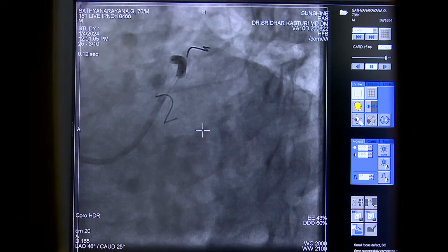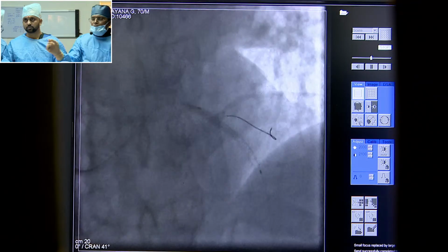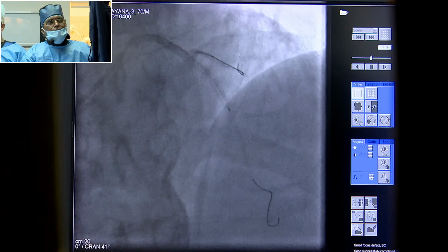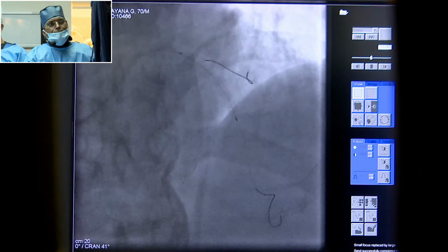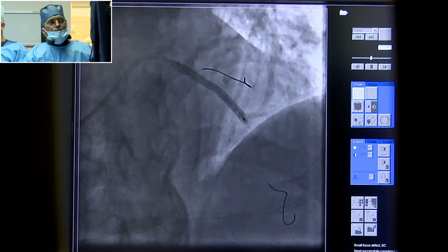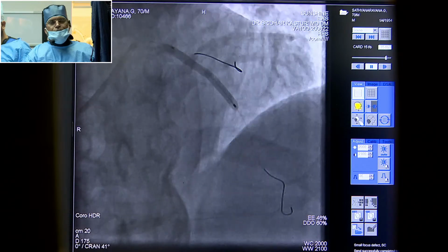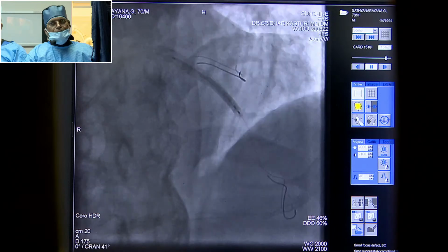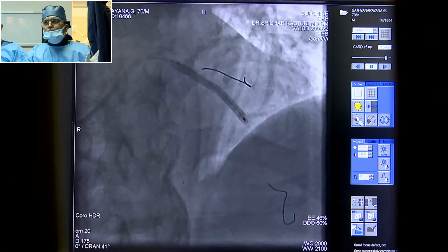Only do nominal. We will take a 4 NC. A small injection. Give a small injection. Side branch is very well protected. Do again. Keep it prolonged. Fibrotic plaque has to be expanded. Maintain for some time, 20 to 30 seconds. Deflate. One more give.